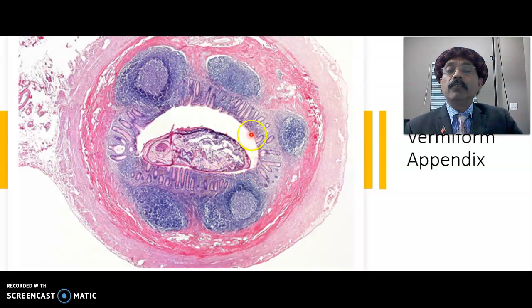The lumen is lined by simple columnar epithelium without villi. The epithelium is supported by loose areolar connective tissue called the lamina propria. This is the lamina propria. It supports the epithelium plus the glands, and it extends up to the submucosa. And usually we have no distinct muscularis mucosa. Okay, that is missing here. So lamina propria is a loose areolar connective tissue. It is vascular.